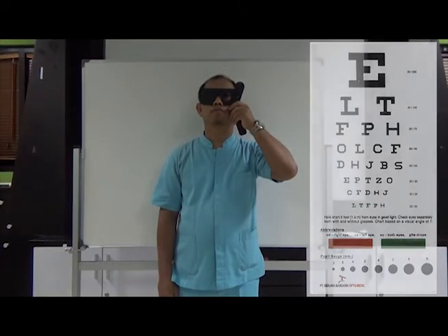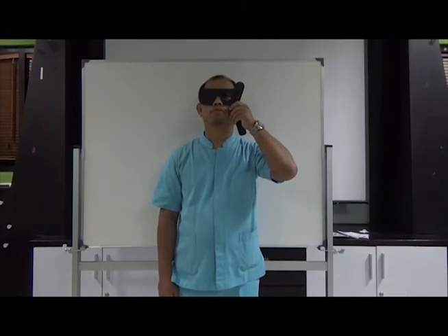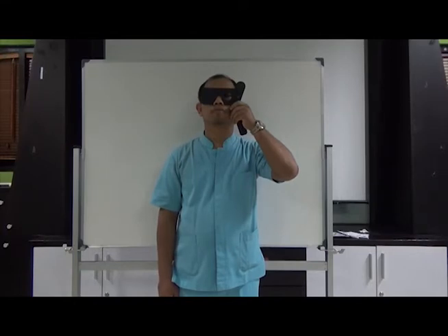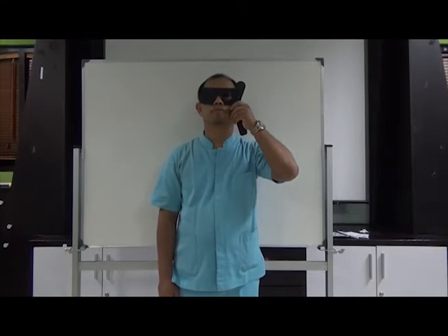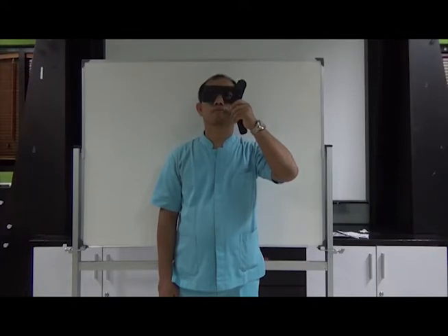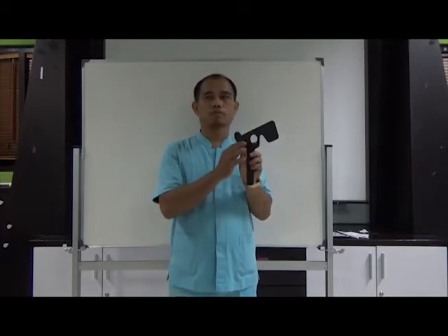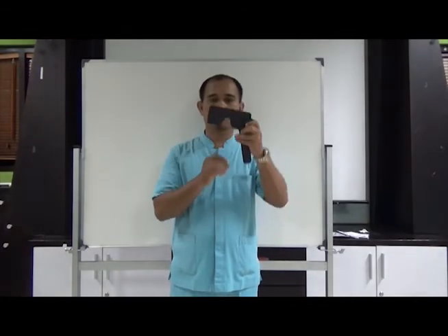Since the visual acuity of the left eye is not at 20/20, that means it is not normal. So we will try to use the pinhole. Can you please bring down the pinhole and use it on the left eye.